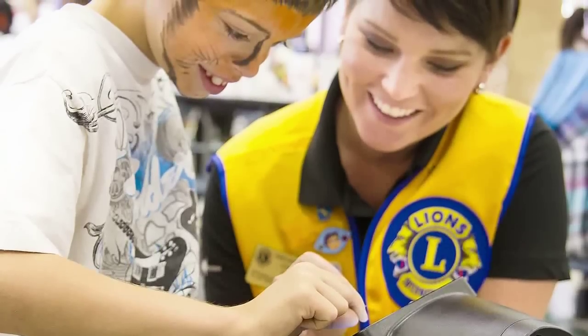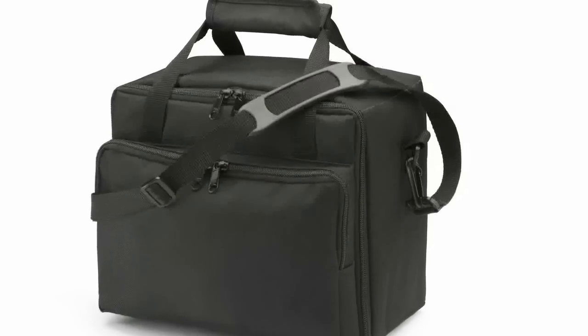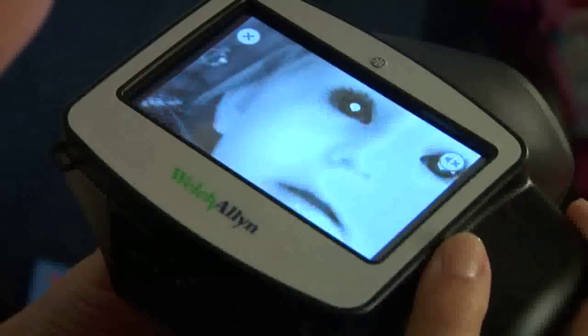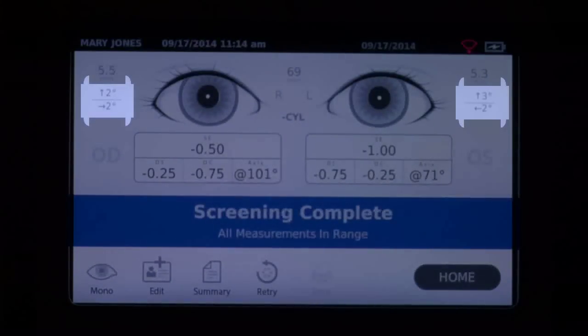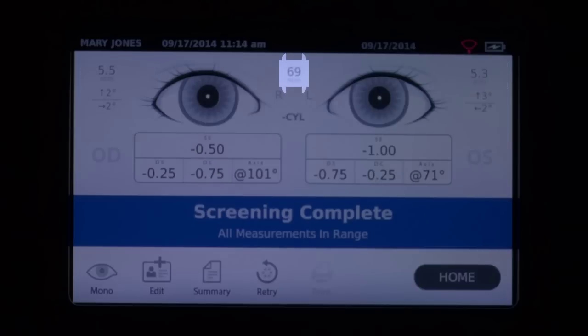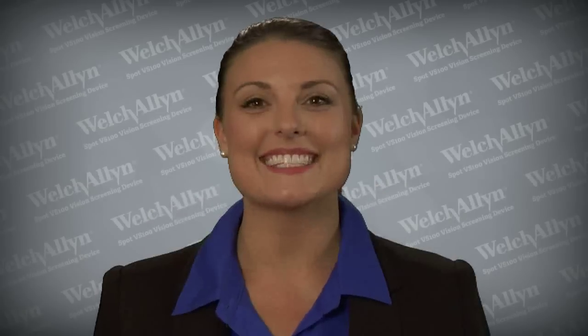Spot goes where you go, whether used in the office or conveniently transported in an optional carry case to schools, events, or mission trips. Instant results provide refractions — monocular or binocular — along with horizontal and vertical eye alignment measurements, pupil size, and pupillary distance. Spot can also be configured in plus or minus cylinder conventions. Best of all, Spot is so easy to use and easy to implement into your vision assessment program. Let's get started.